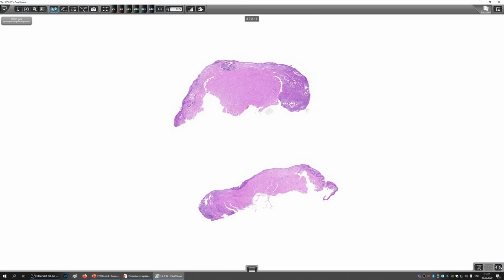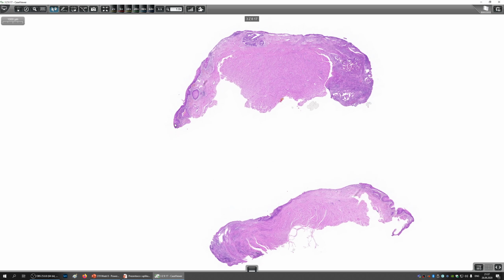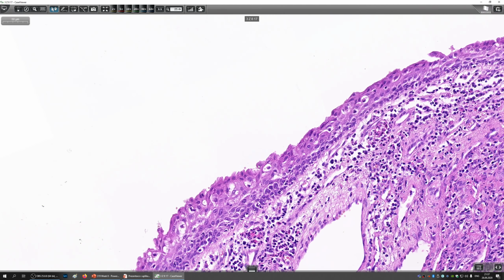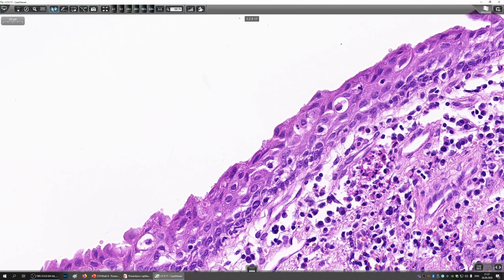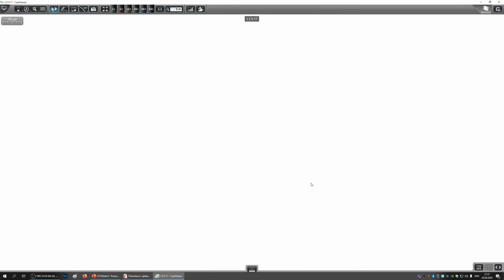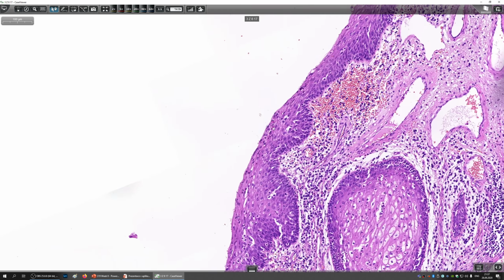So in these cases, here this is a very serious chronic urocystitis. So one of the things that is interesting, that most of the urothelium is gone. So this is an area of urothelium which is still there. Here you see the umbrella cell. So this is how a reactively changed urothelium looks like. And due to the chronic inflammation, something interesting happened to it, and that is squamous metaplasia.